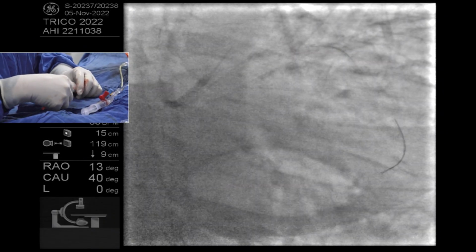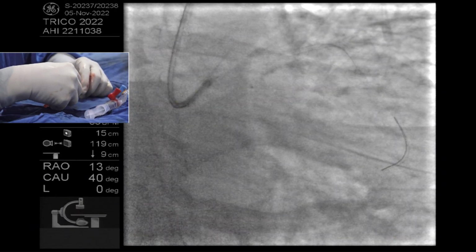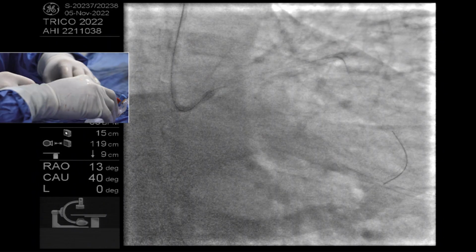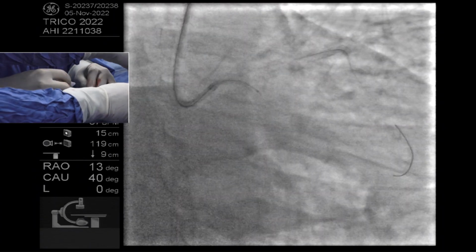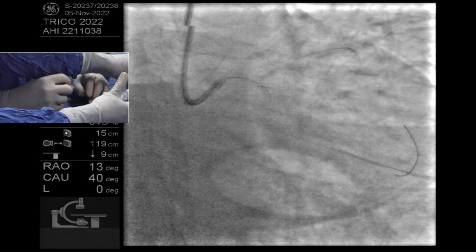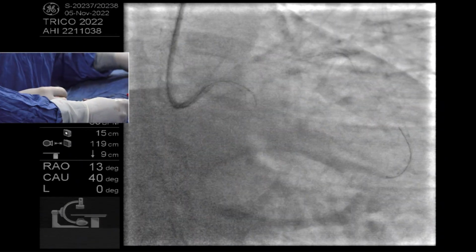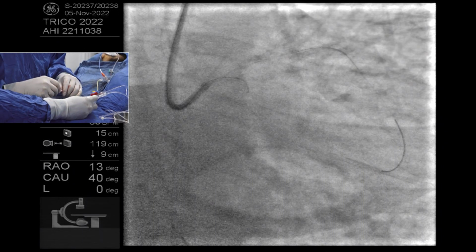Who makes SuperCross? I think it is Teleflex. All I know with the SuperCross is that it has a 90 and a 120, so always use the bigger one, the 120. It straightens out at least 30 to 40 degrees.